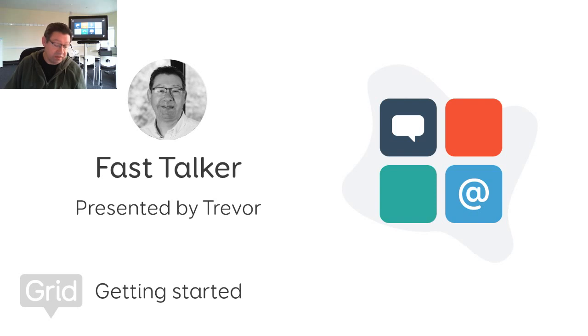So it's designed for fully literate users using any access method to give them the tools to be able to speak out loud quickly and efficiently, but also to retain independence and be able to do all the other tasks on a computer that we all do day to day. So it's available in two versions.